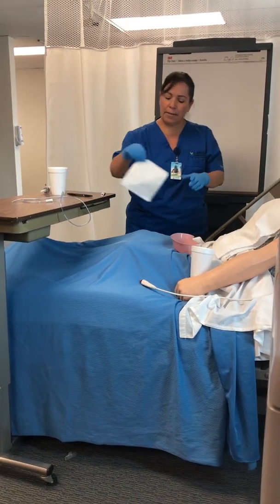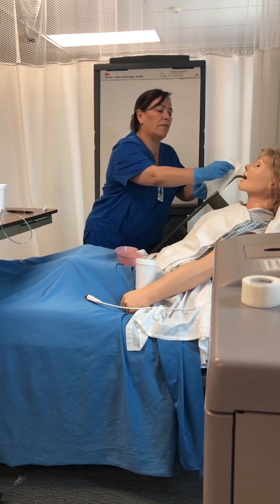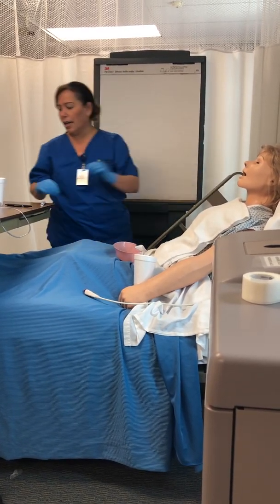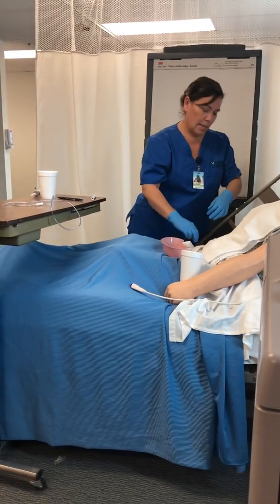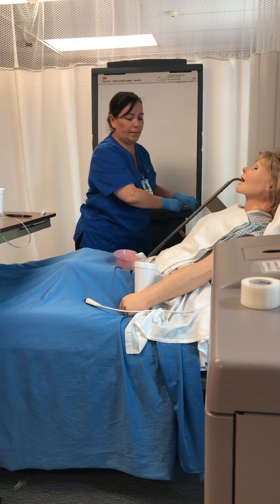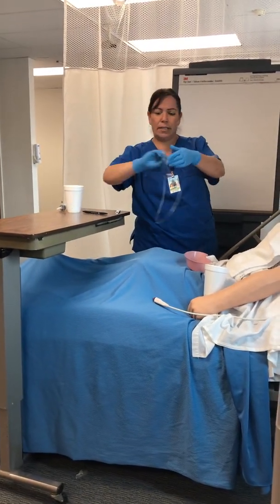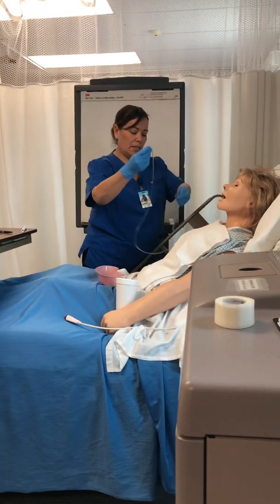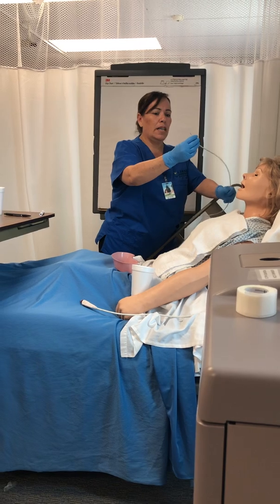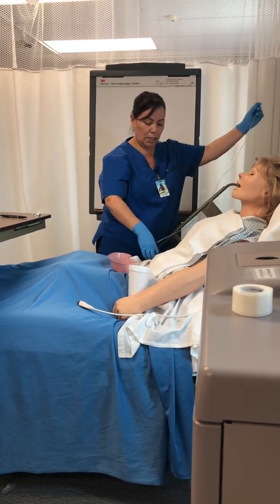So I'm gonna ask the patient to blow his nose before we do the procedure, okay? And then I'm gonna wipe the nose. And then now I'm gonna measure the NG tube, and I already explained the procedure to the patient. And I have him in a semi-Fowler's position.